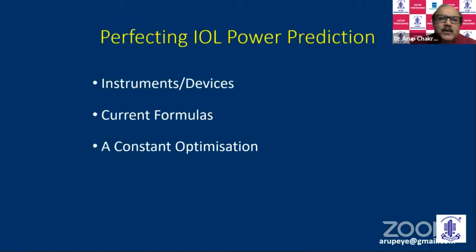So we had newer, more sophisticated instruments coming into the market, which were able to measure the dimensions in a much more accurate and precise manner, in addition to giving more biometric parameters.